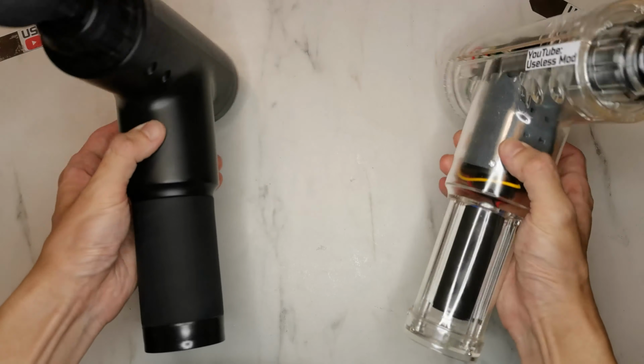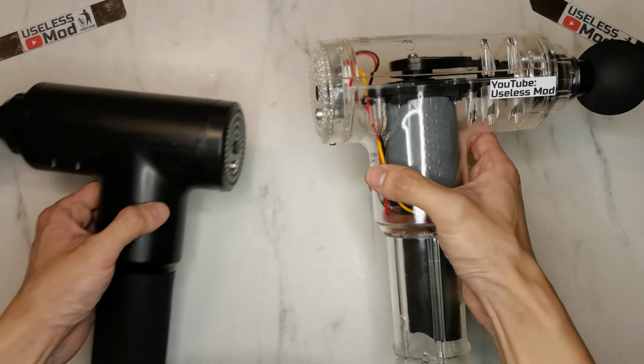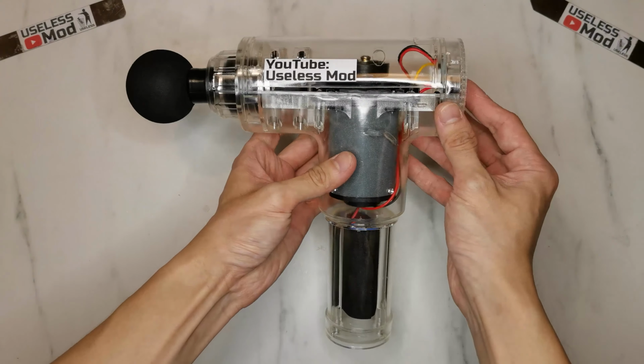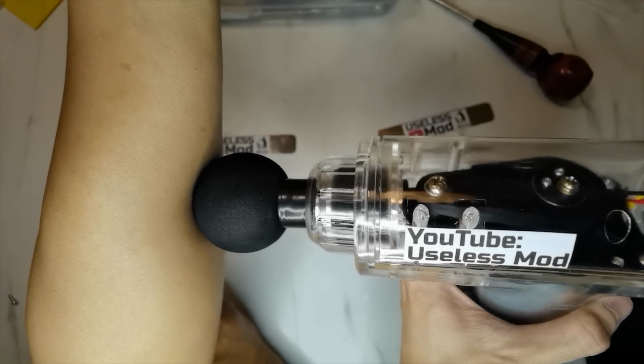All the inside components are clearly visible, and you can see how a rotational motion transforms into linear motion. And I took some slow motion footage so you can see how it works. Stay tuned for the disassembly, case making, and slow motion video.